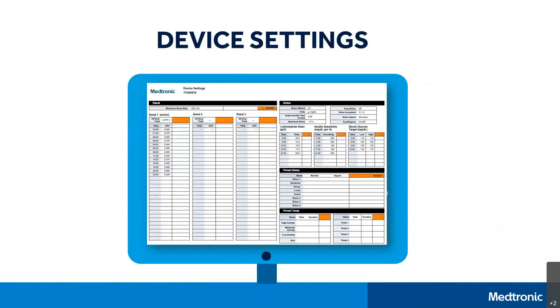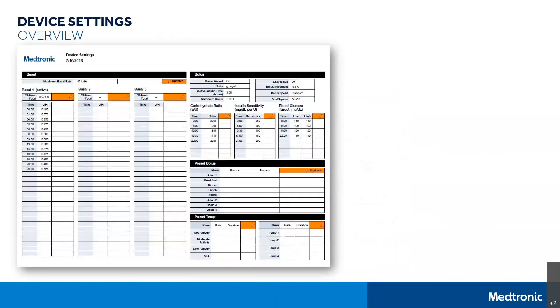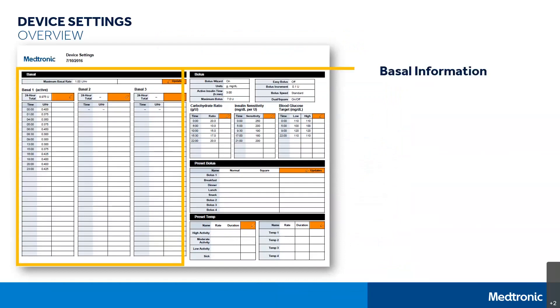The last report is the Device Settings Snapshot. This is a great tool and important to evaluate periodically. It's also important to have your settings downloaded in the event that you need to reprogram your pump or receive a new device. On the left of the report you will see your current basal rates — if there are multiple patterns, the one labeled active is the one currently being used. On the right-hand side you will notice the bolus wizard settings, which include the carb ratio, insulin sensitivity, blood glucose target, and active insulin time. Please note that if you're using a MiniMed 530G pump, your settings page might look slightly different — check for your settings in the middle of the report.